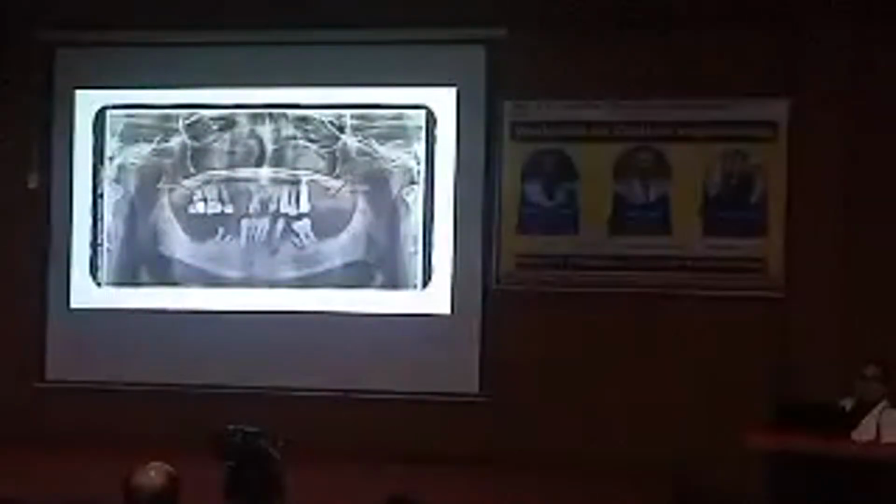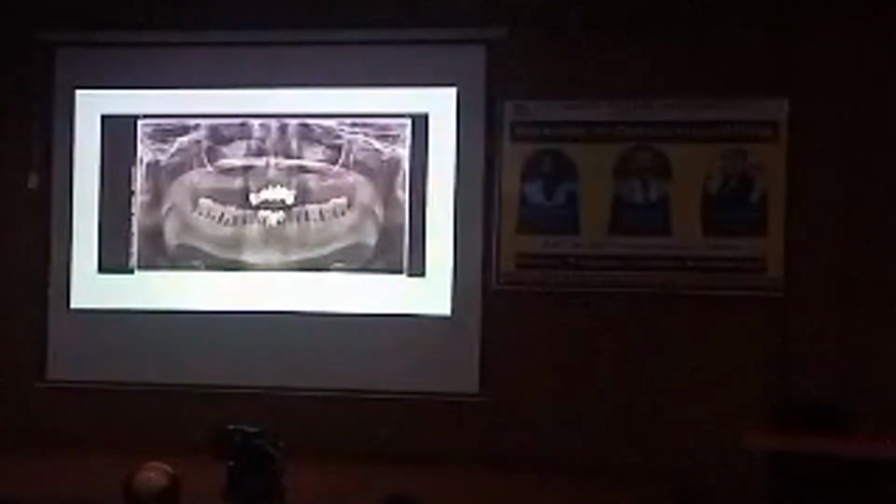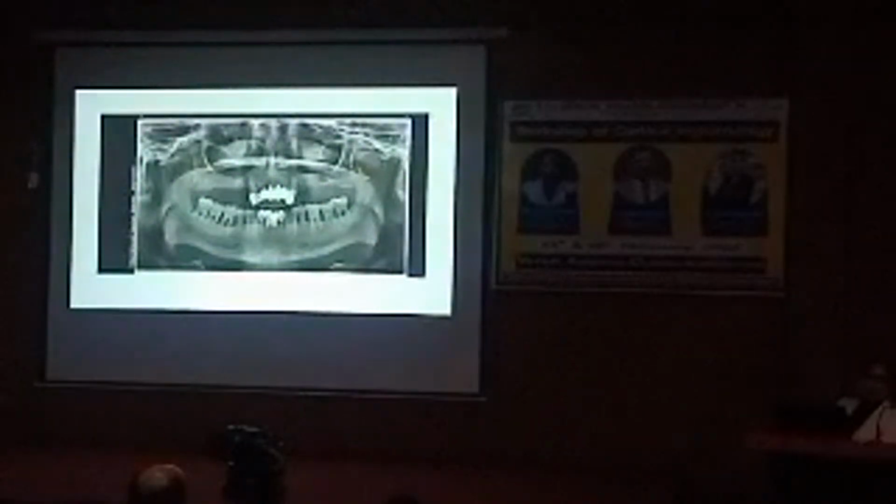This is the exact same thing you will do in the patient. Next, trace the tuberosity. This is the distal of maxilla, this is the pterygomaxillary fissure. These are the pterygoids. I have already marked them. Can you appreciate this? Are you able to see the pterygoid plates? Because if not, then you will not be able to do independent cases. Until tomorrow we are there, we'll tell you. Maybe we'll hold your hand and let you know, but after that you need to do it yourself. And this will be your vertical angle.